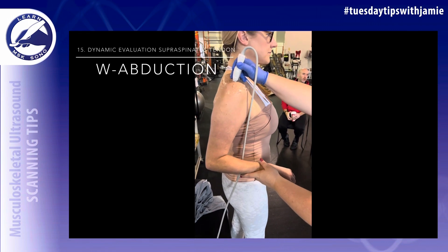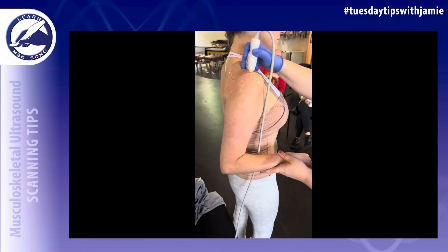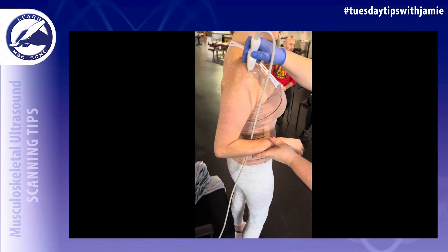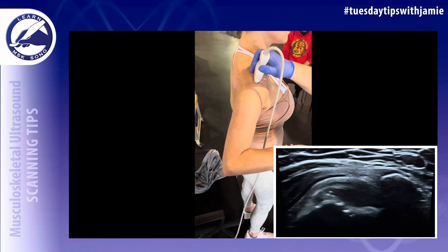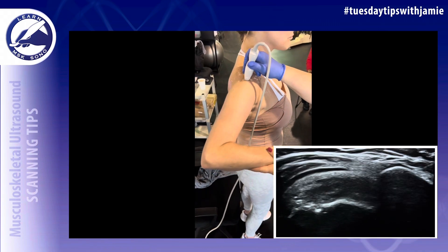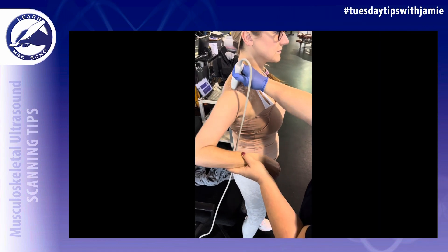For dynamic evaluation of the supraspinatus, use the AC joint as your landmark, then slide laterally to the acromion until the supraspinatus comes into view. Have the patient abduct their arm — like flapping a wing — to confirm that the supraspinatus tendon slides under the acromion with abduction.